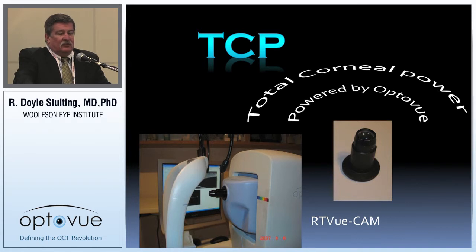So we employed it to understand some of the nuances of corneal collagen cross-linking, the relationship of the corneal contour in keratoconus eyes, how it gets that way, why the cornea steepens shortly after cross-linking and whatnot. So it was really an addition to our armamentarium.